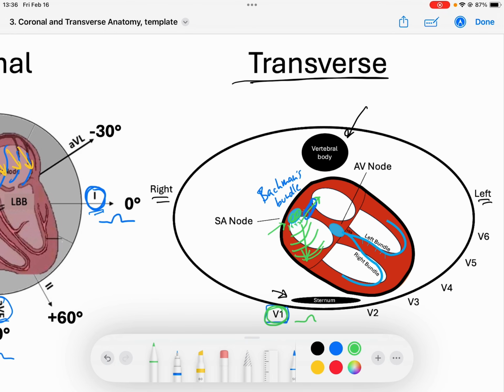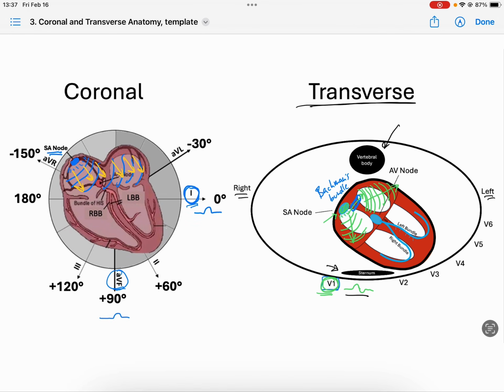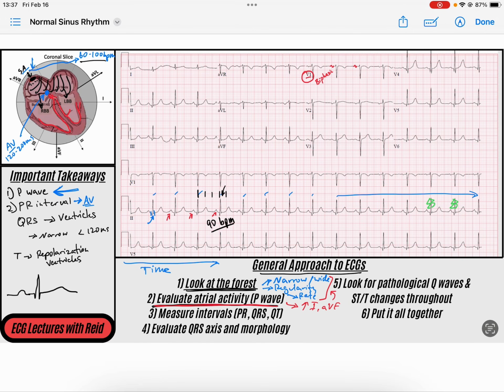And it enters the left atria, and look at the direction that the left atria will then depolarize just a hair after the right. It's going to depolarize kind of towards the lateral side. And so that is away from V1. And so the second half of atrial depolarization in V1 will be represented by this negative deflection. And so those are representing the biphasic pattern of atrial depolarization. And so in V1, you will often see a biphasic P wave. So these are all characteristics of my sinus P wave, right?